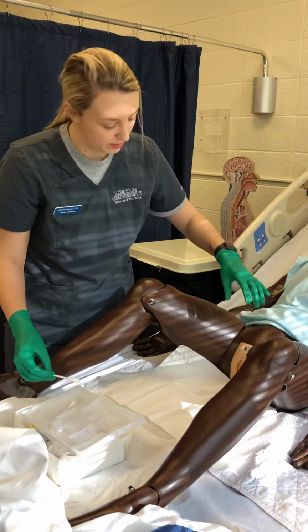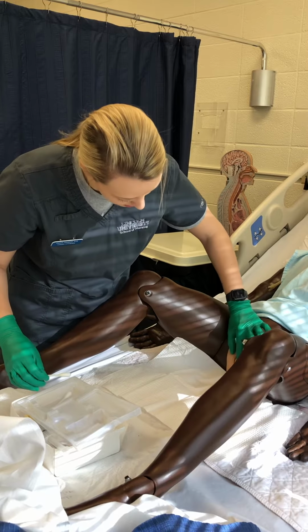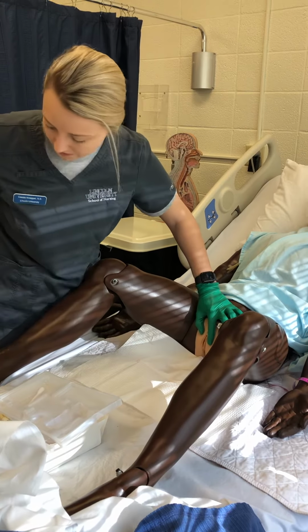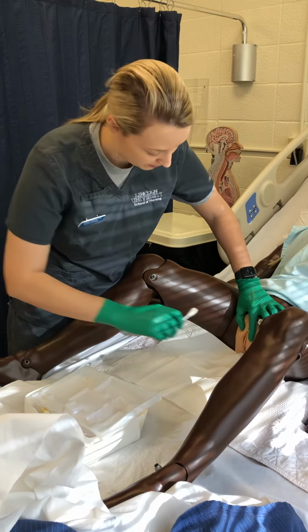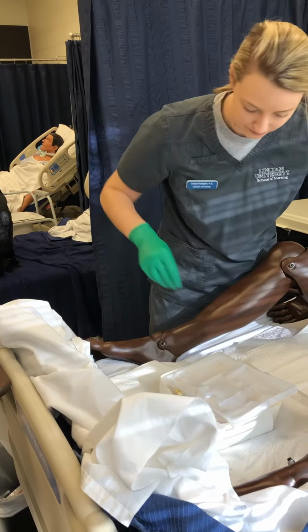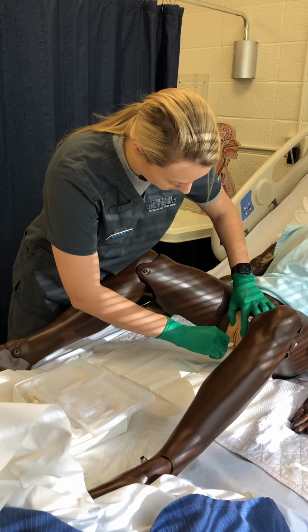So then I'm going to go ahead and touch you, and then I'm going to clean off your area again with 3 swabs. So go down one side just like last time. Down the other side. And then last one down the middle.